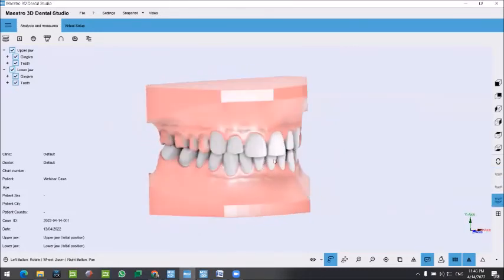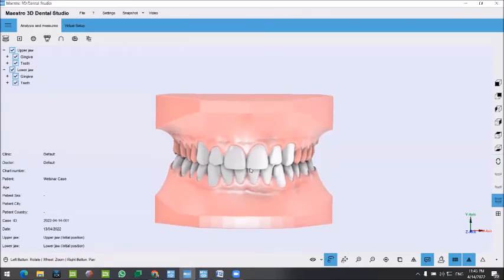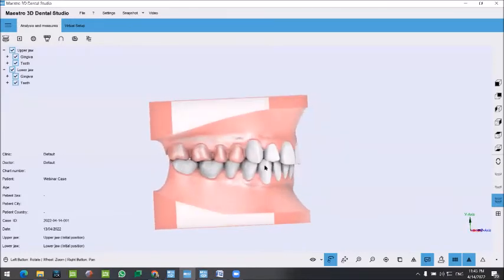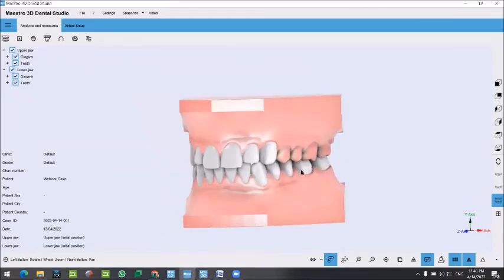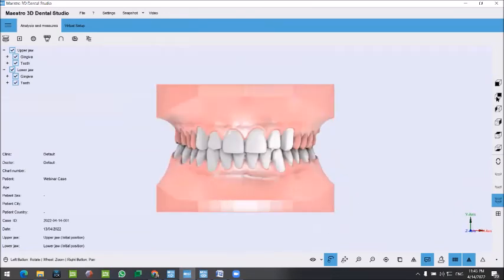We have another question here. Do you need any kind of X-ray to do your planning? And if yes, which is most preferable? We don't need any X-ray to process a case, but it's very beneficial to have one if we have an impacted tooth or an extracted tooth or a missing tooth. It can be a Pan-Rex, it can be a CBCT, anything just to see the bone, if they have a pathological region or a pathology in the bone.